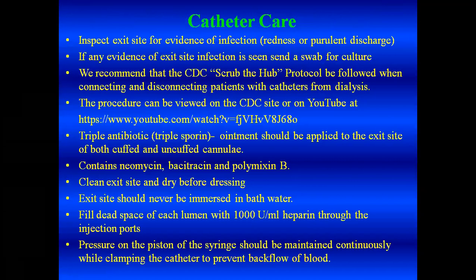Okay, so much for AV fistulas and AV grafts. We also have an increasing use of tunnel cuff catheters in our dialysis units. It's said that nephrologists hate catheters but cannot live without them. So we face this conundrum, and therefore if we cannot live without them, we at least have to take all possible care of them. So we need to inspect the exit site for redness or purulence. We need to give some pressure over the tunnel to make sure there isn't tenderness or localized collection.